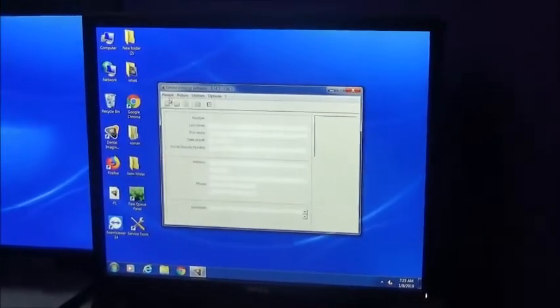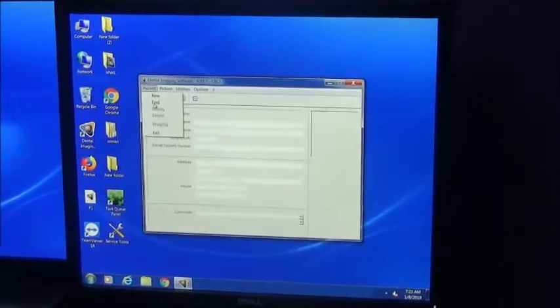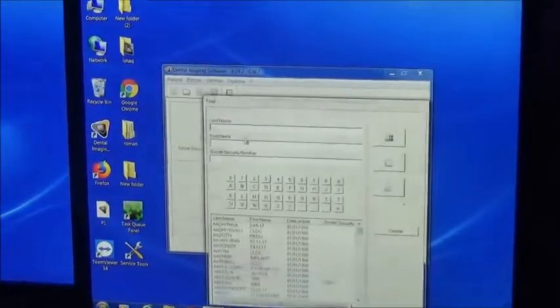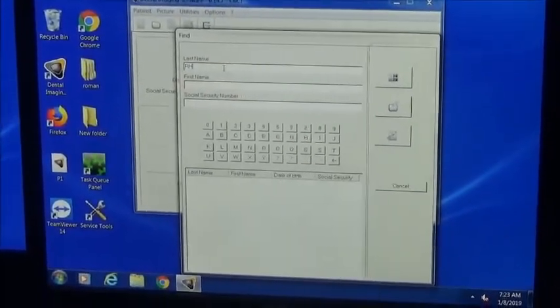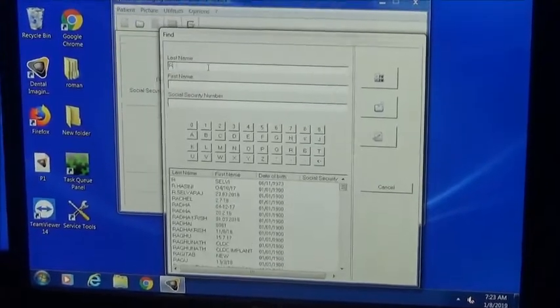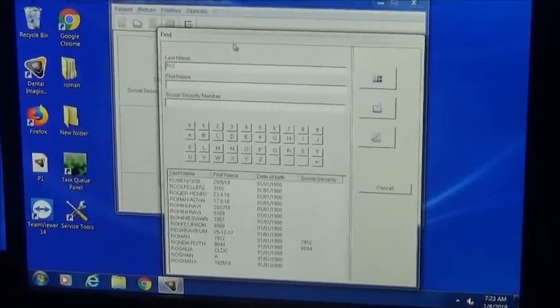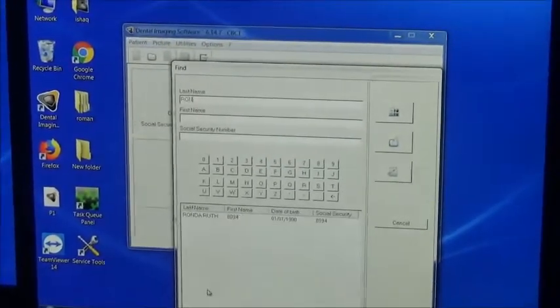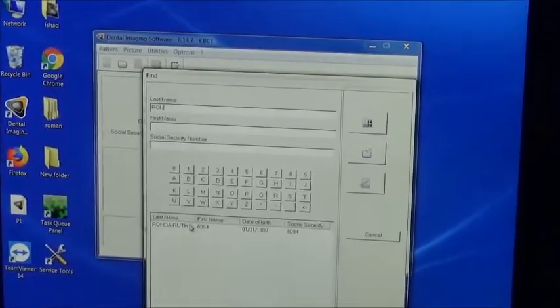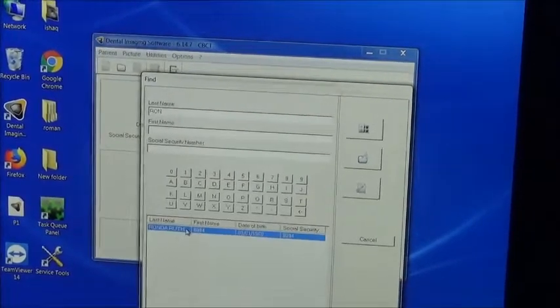You click the patient, then you click find, then you search the patient you want to open. Open RO — Ronda — you double click that.